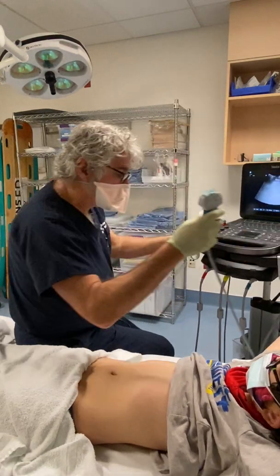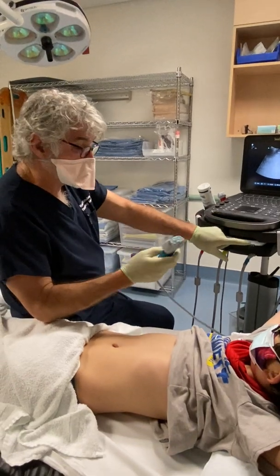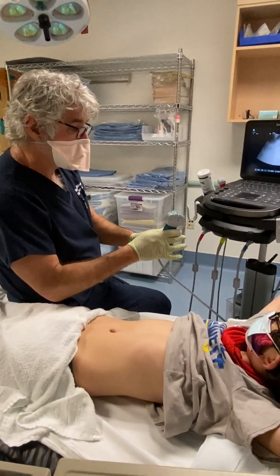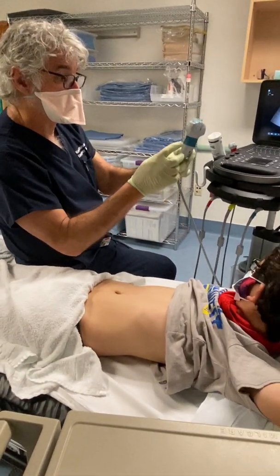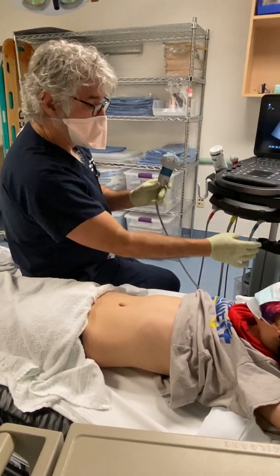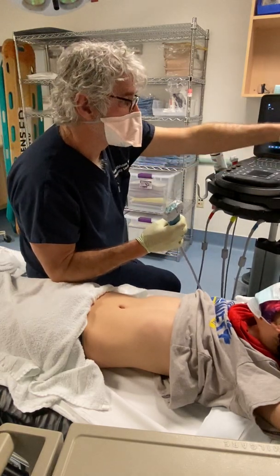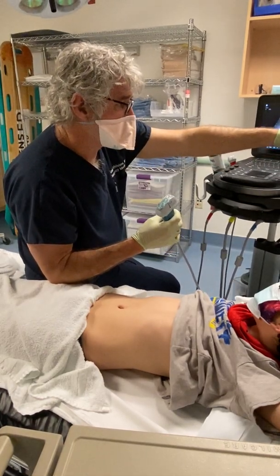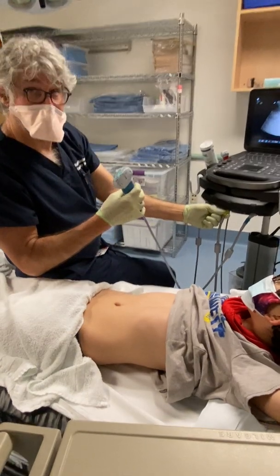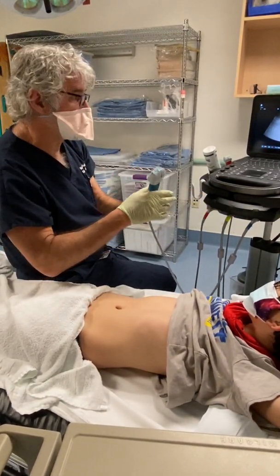After turning on the machine, you'll pick the probe by pushing a button associated with it. On this machine we have them color-coded. This probe is color-coded blue and goes right here. This probe is color-coded a sort of pukey yellow, and that will go to this button right here. You just push the button to select the probe.